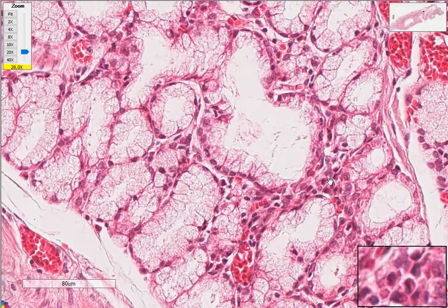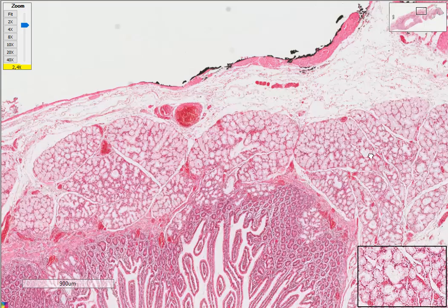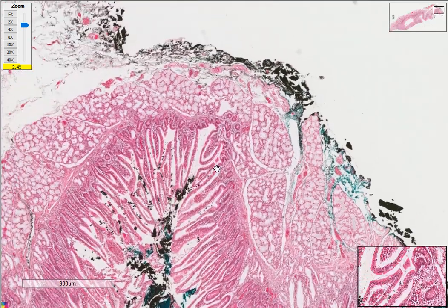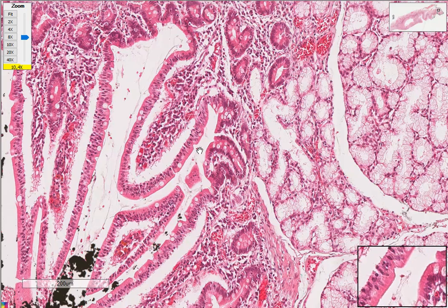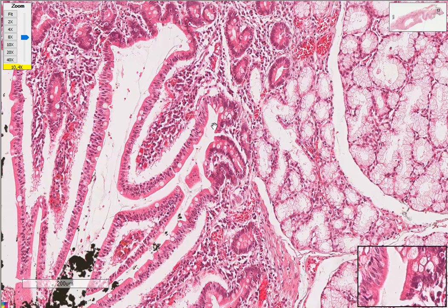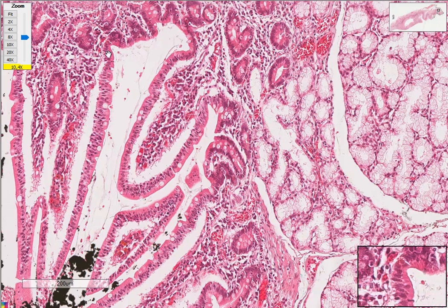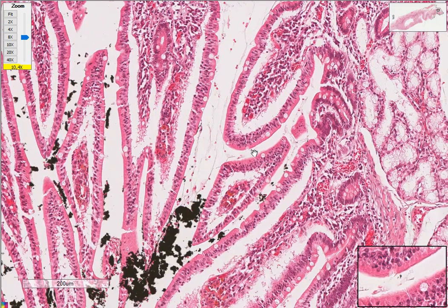Okay, and the architecture and histology of the duodenum isn't so difficult. There's also something we forgot to highlight: the crypts of Lieberkühn. They extend downwards. So you've got your villus projection, which projects upwards, and then your crypts of Lieberkühn, which project downwards. Okay. So now let me go through the functions of each cell type for you.